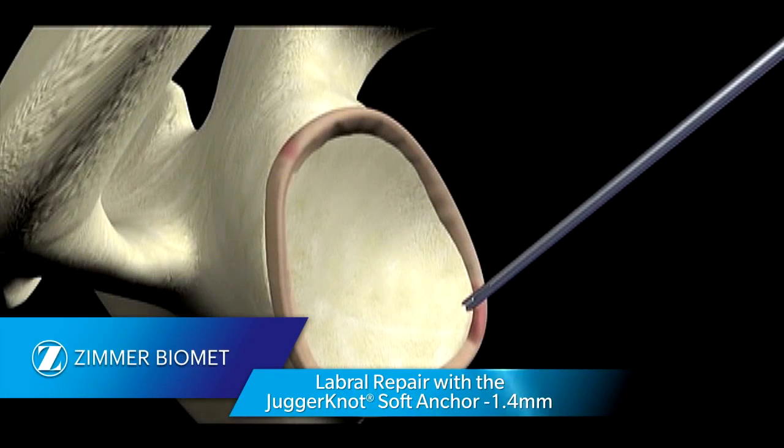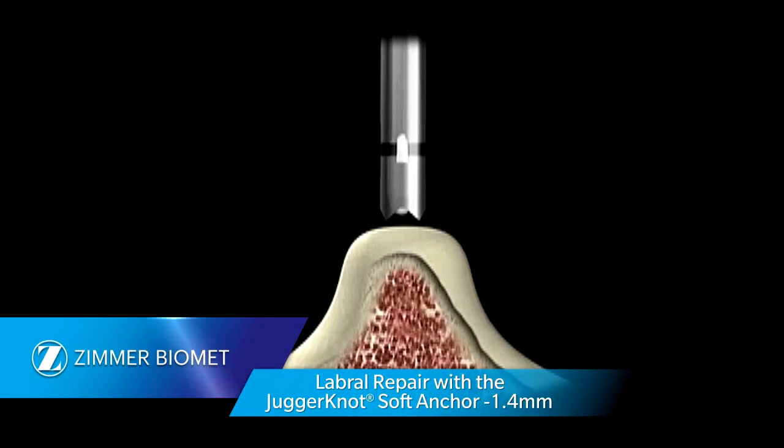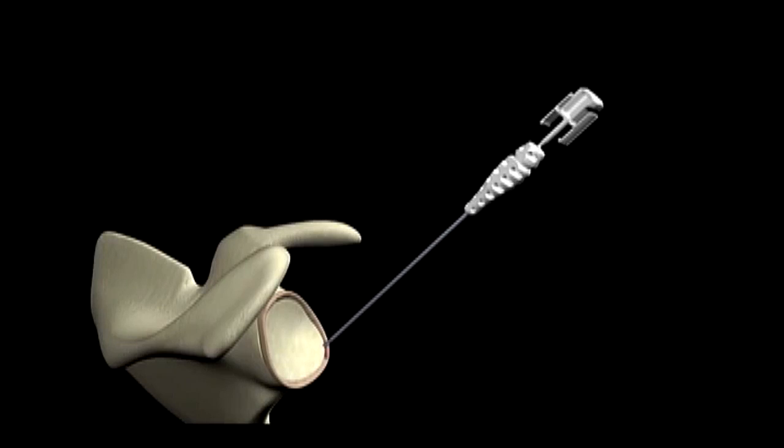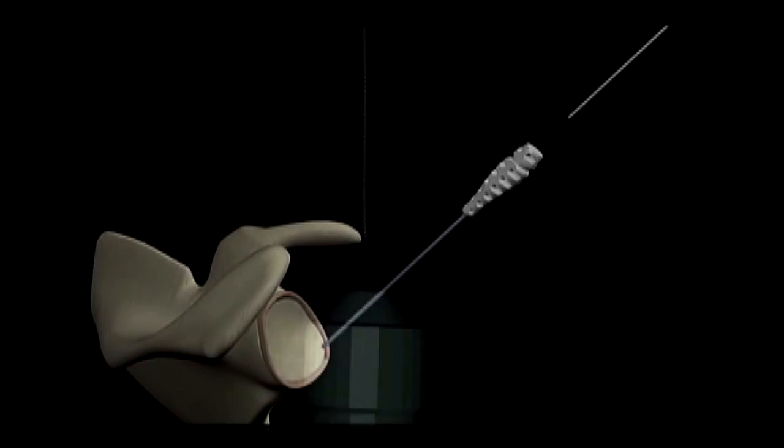Position the JuggerKnot guide to the desired location on the glenoid bone via a cannula or percutaneous portal. Remove the obturator from the handle of the drill guide.